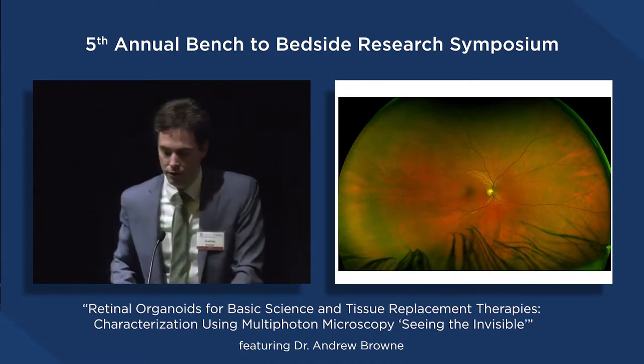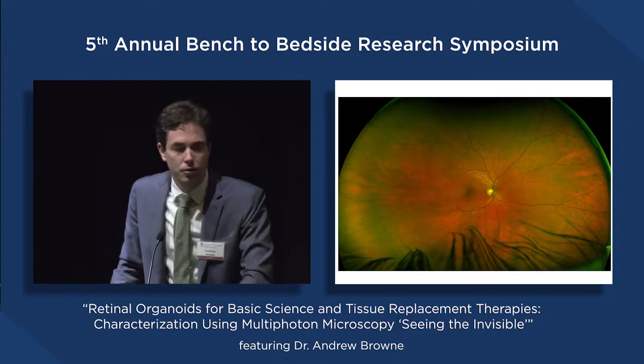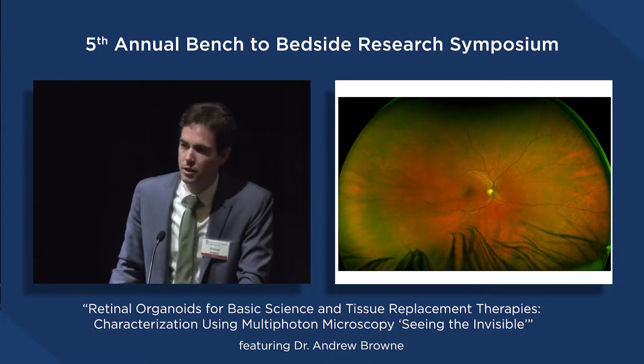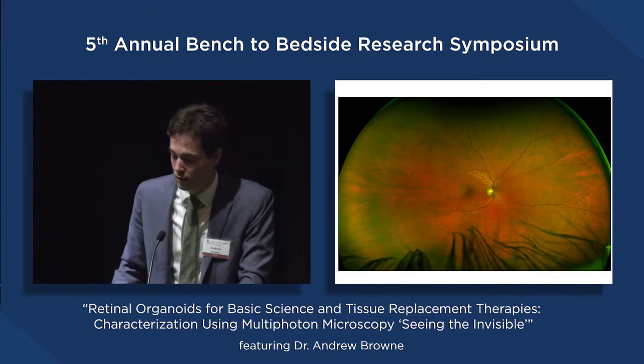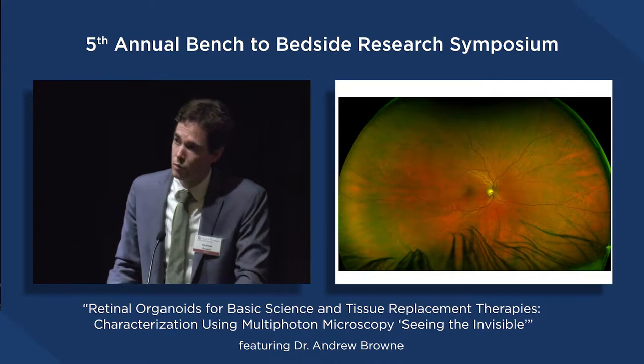And so here's a photograph of a patient who I saw a couple weeks ago. And this is a color fundus photograph. It shows you the beautiful anatomy of the inside of the eye that we're looking at routinely. And at first glance, it actually looks pretty darn normal. If you've looked at thousands of these, you start to be able to pick up the nuances of what is abnormal. But we use a lot of photography techniques to try and look at normal and abnormal things in ophthalmology.